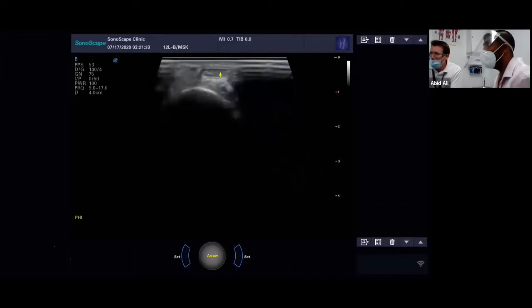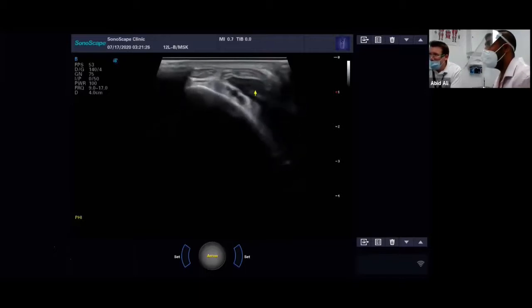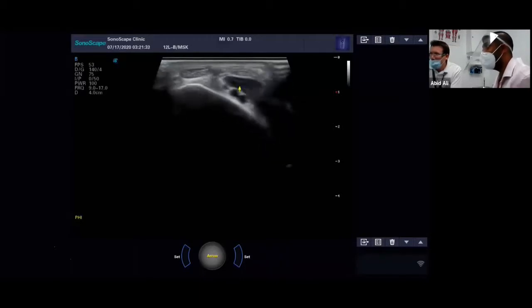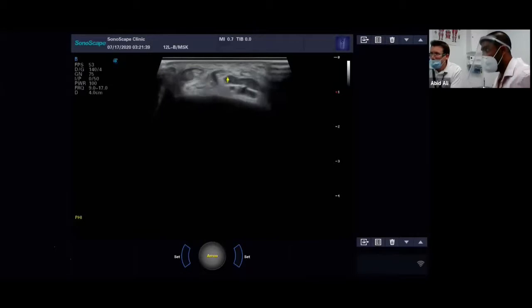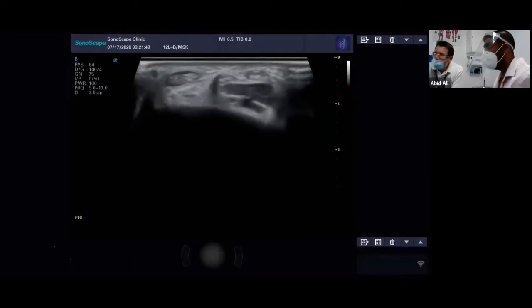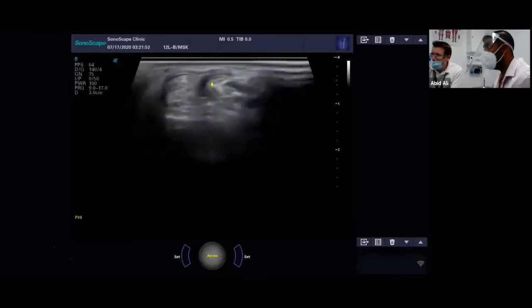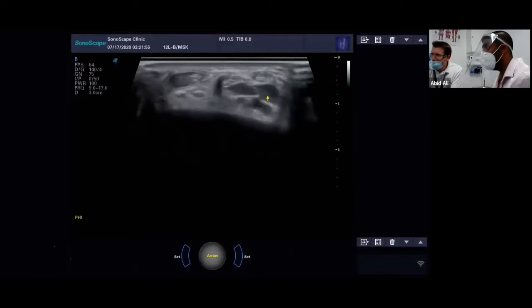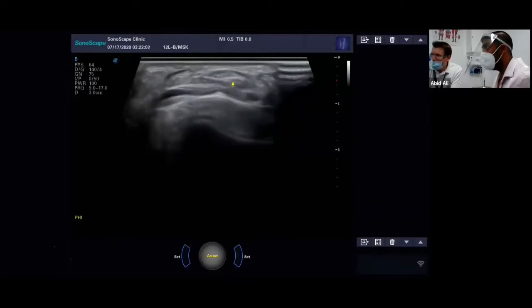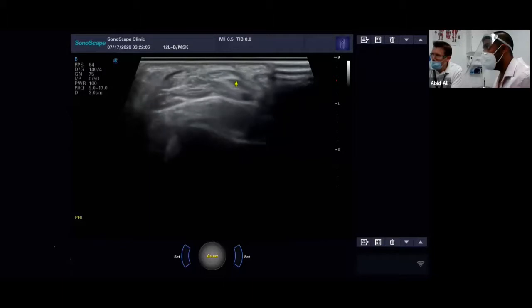Let's give your ankle a bit of movement up and down. See the tibia moving there. Then, if you wiggle your big toe, Adrian, you can see the actual muscle belly of Extensor Hallucis. We'll go down a wee bit further. You can see it starting to form into a tendon. You can help yourself find your anatomical positioning by asking the patient to move the ankle, the big toe, or even the little toes. Let's go down a bit further. Can you see how the muscle belly is starting to disappear as I move distally down the foot, and now it's just become this thin, more ovoid shape, which is the tendon itself.